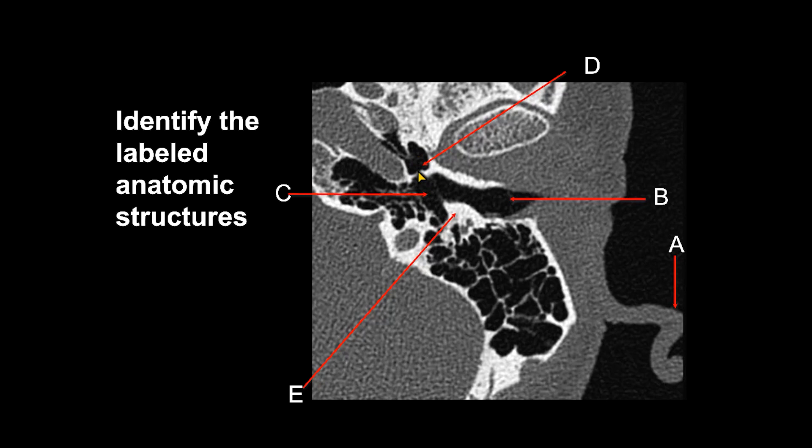D is the anterior epitympanic space — a portion of the middle ear cavity residing further anterior. E represents the bony portion of the external auditory canal.